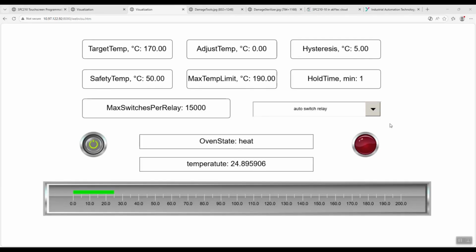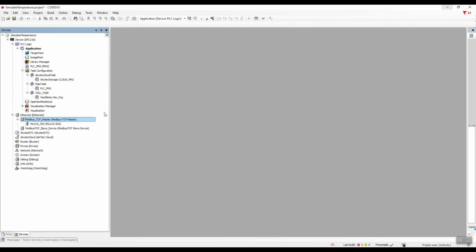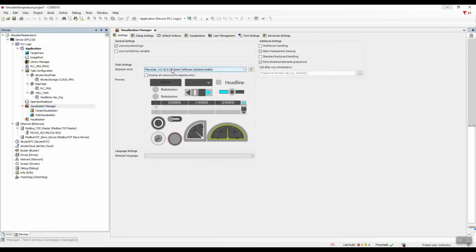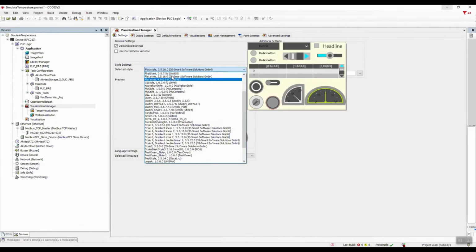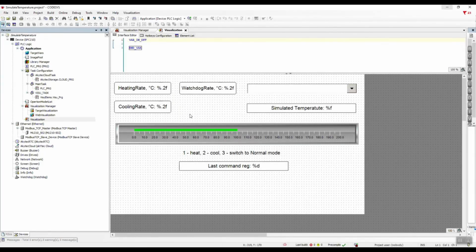Now let's move on to the surprise section and show why the visual components of the emulator project are different from those in our main project. To do this, let's go to the Visualization Manager, and let's change the selected style setting to default. Now let's go back to the Visualization Editor, and as we can see, now the visual display of our components is updated accordingly. It is the same as in our main project. Let us know in the comments which visualization style you like more.